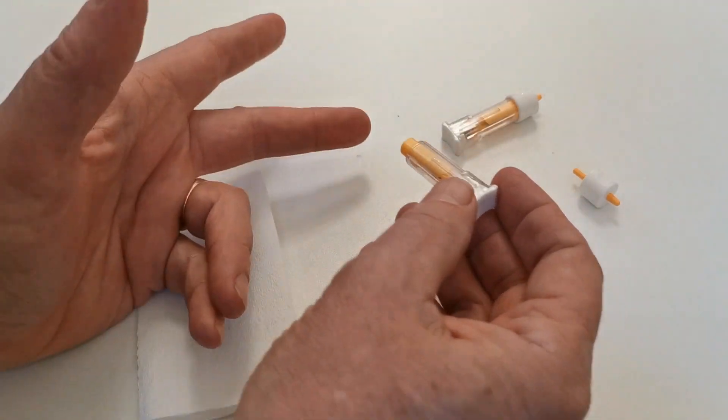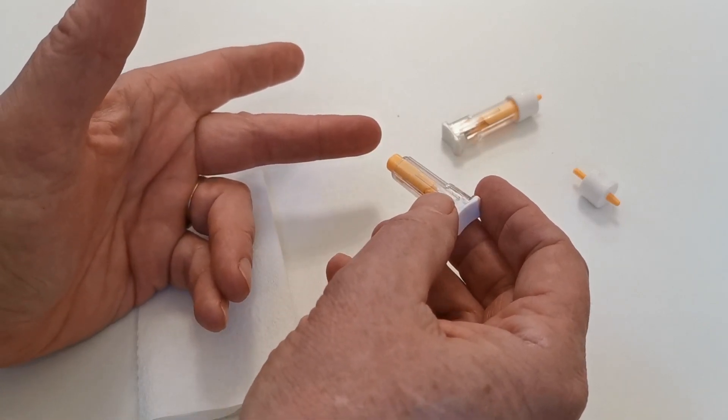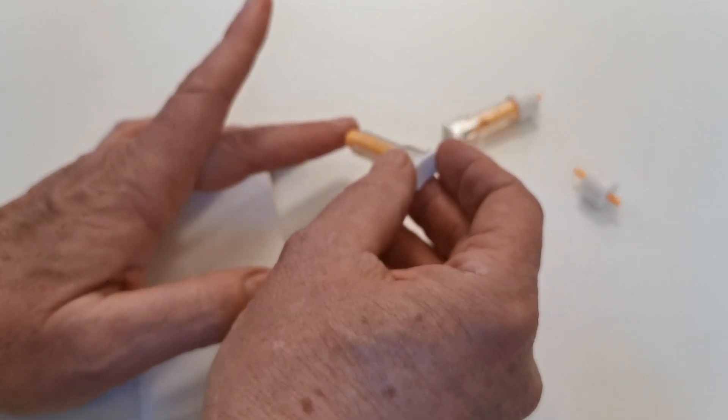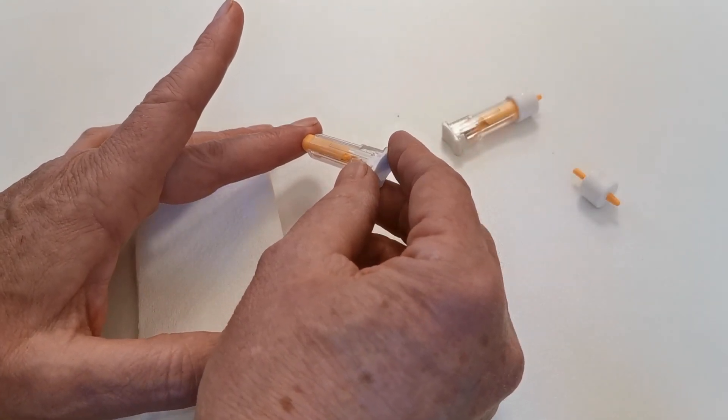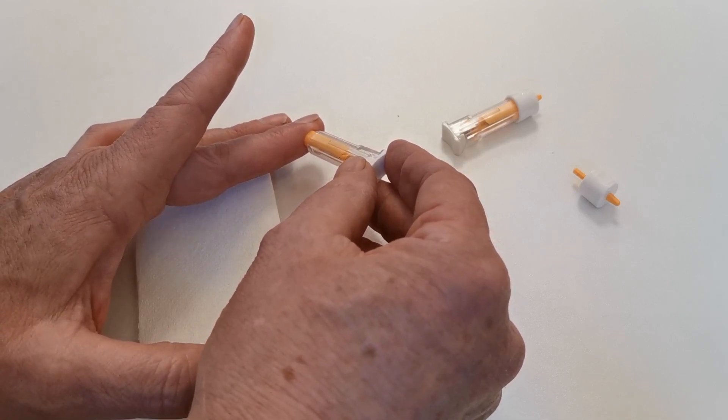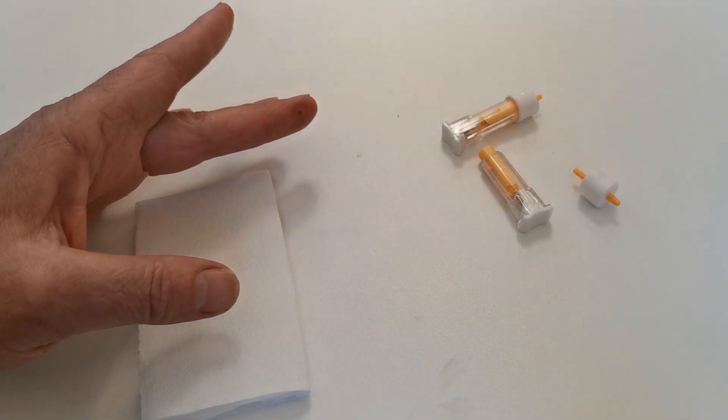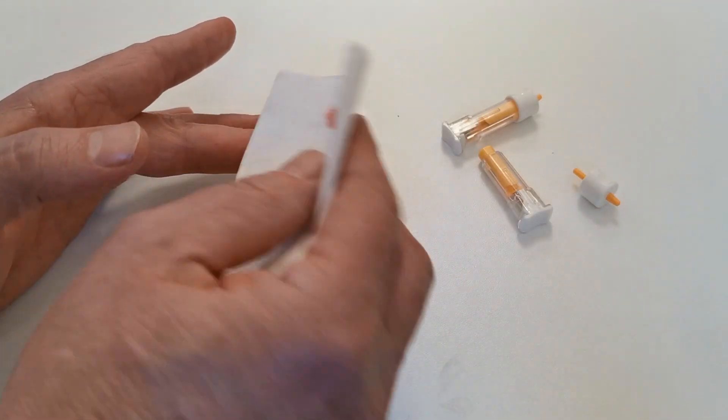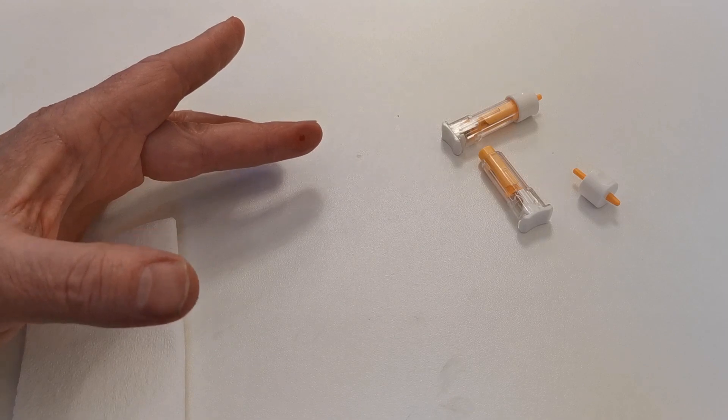Then, to perform a test, you'll note I'm not putting it on the flat of the finger like this because this area is quite fibrous. There's also a lot of sensation in that end. It's far better to actually run your lance on the side of the finger. To perform the lance, put it firmly against the side of the finger and push. You'll see that the lance has automatically formed a first droplet of blood. Remove that and allow the second droplet to form completely naturally.